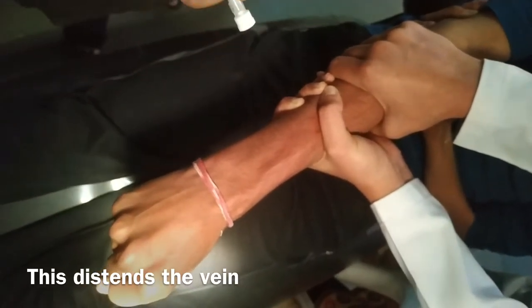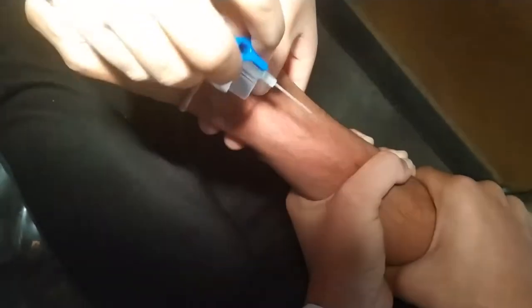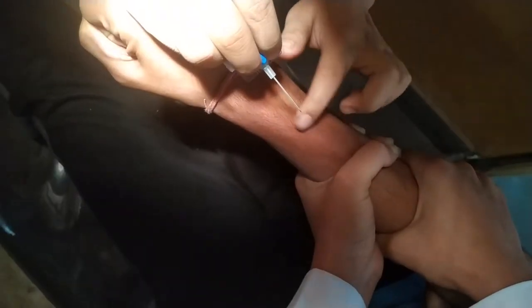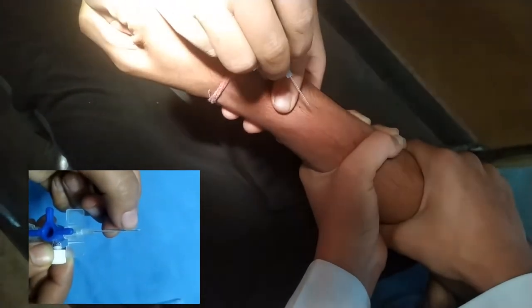Distend the vein and palpate it with your finger before inserting the cannula. Remember to stretch the skin, otherwise there will be movement. You can see here — stretch it properly. Whenever you insert the cannula, the bevel should always face upwards.